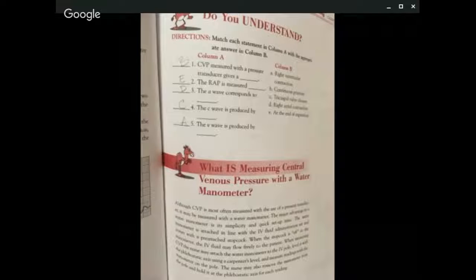What is measuring central venous pressure with a water manometer instead of a transducer? Although CVP is most often measured with the use of a pressure transducer, it may be measured with a water manometer. The major advantage of the water manometer is its simplicity and quick setup time. The water manometer is attached in line with the IV fluid administration set and comes with a pre-attached stopcock. When the stopcock is off to the manometer, the IV fluid may flow through to the patient.